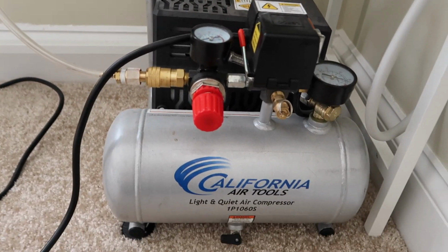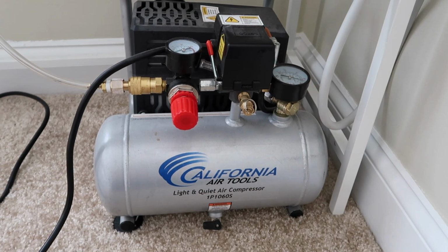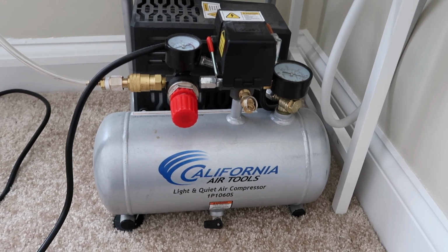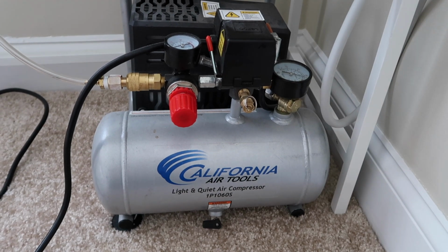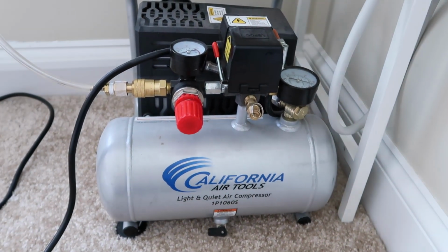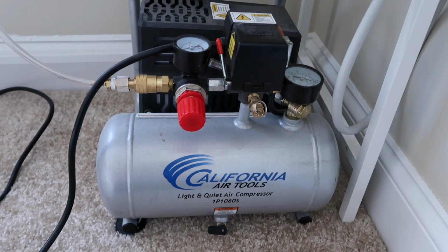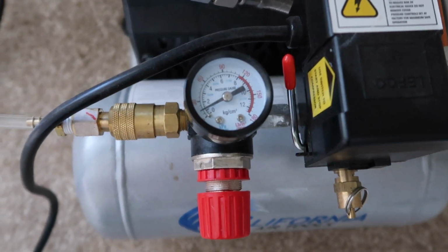The compressor is on at the moment, and it is very important to know the settings of your compressor. I did not pay attention to it the first time I connected it, and I really quickly burned my handpiece because this is a compressor that is not meant for dental purposes. It's meant for home improvements and big construction works. So the pressure in these can be really strong, so make sure you adjust the pressure using this knob, and it should not be more than 30.